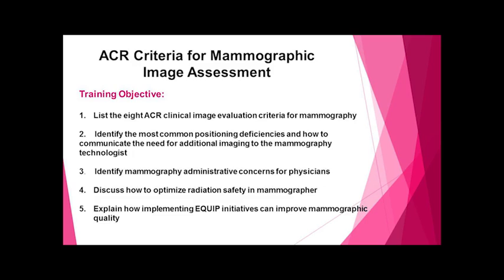So let's talk first about our training objective. We're going to be reviewing the components of mammography accreditation as it relates to image quality. We're going to review the ACR clinical image parameters, and we're going to provide the interpreting physicians with some of the technical knowledge that they'll need so that they can communicate the quality expectations to their mammography technologists.